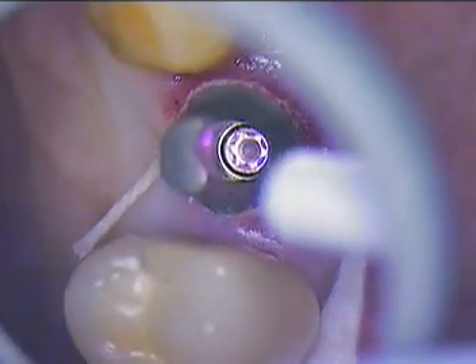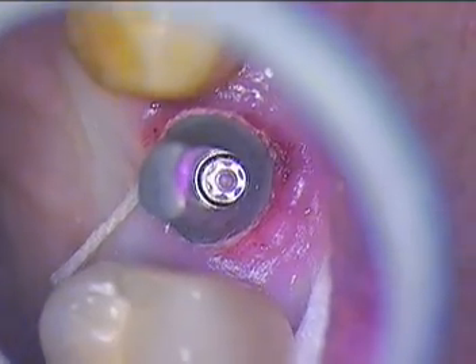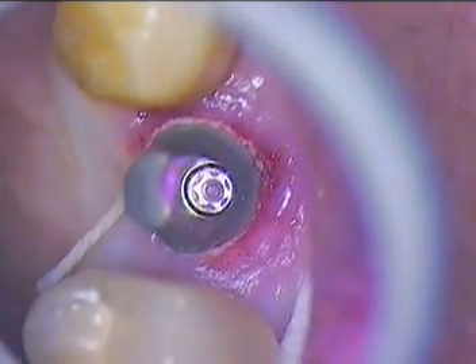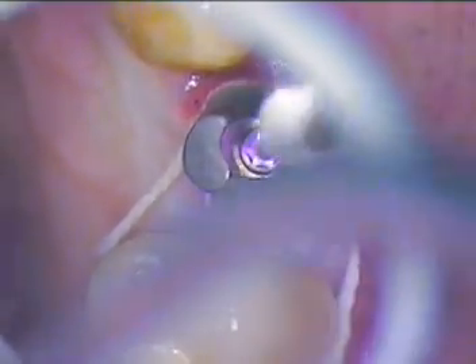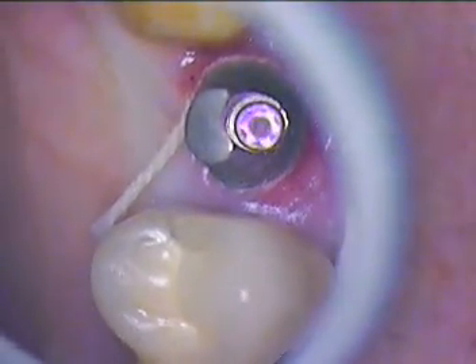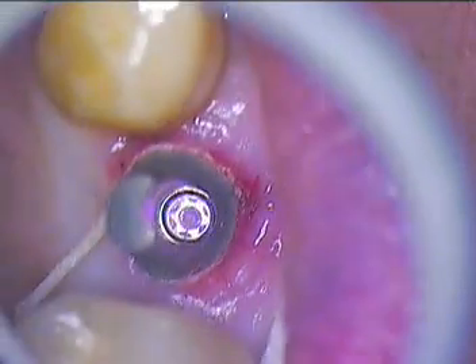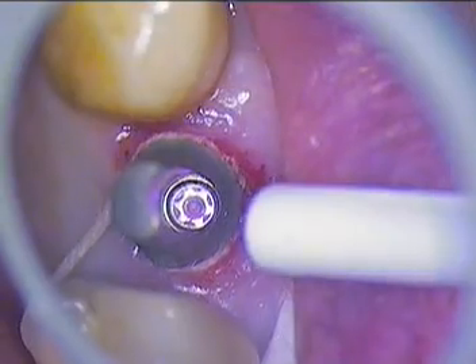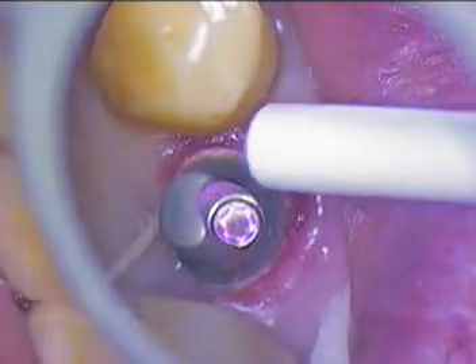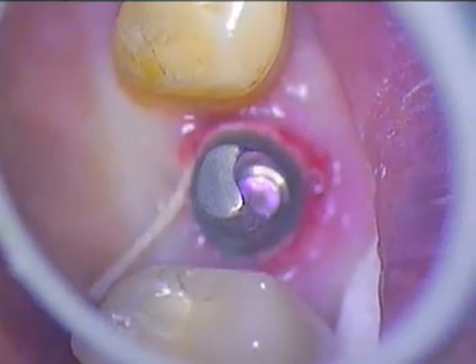There's the screw head, staring us down. That means I want to put cotton and a little wax in there. So here comes the cotton, and we'll push that in. A little too big — I need about half that size. I'll transfer with these and we'll just keep it nice and dry. Interprox and facially is a little more important I think than the lingual aspect, although we do place the cord completely around the tooth.